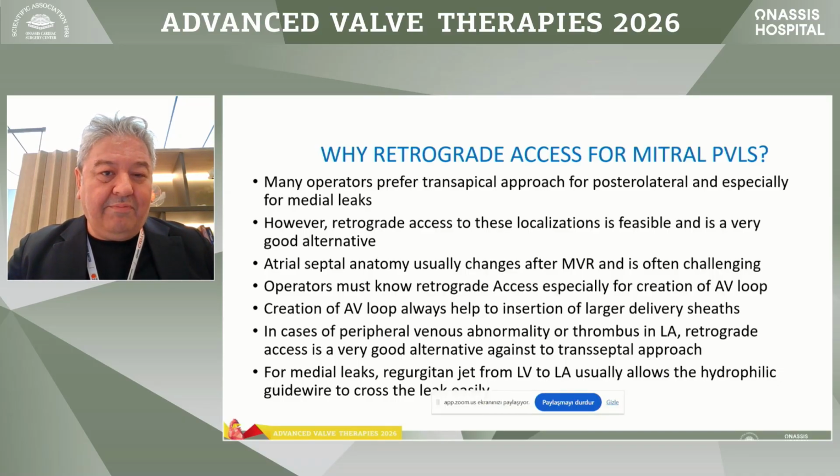Many operators prefer the transapical approach for posterolateral and especially for medial leaks. However, retrograde access to these localizations is feasible and is a very good alternative. And atrial septal anatomy usually changes after mitral valve replacement and is often challenging.